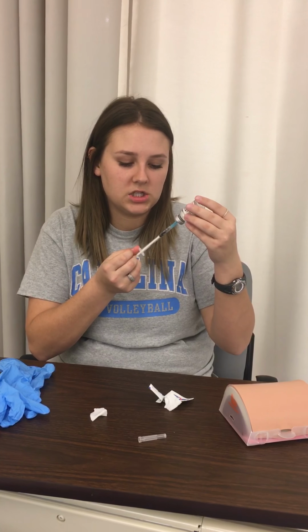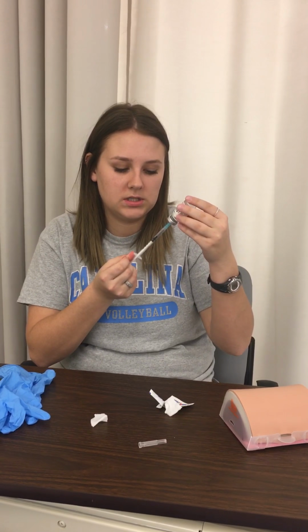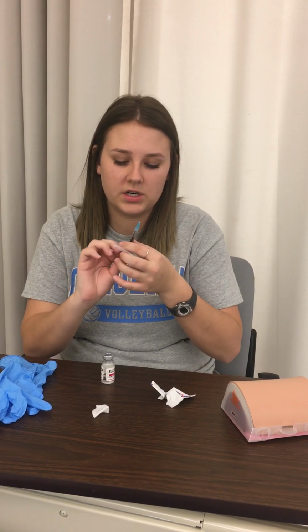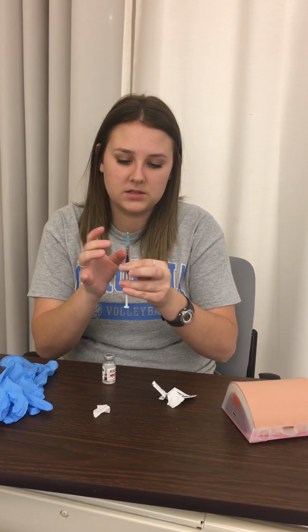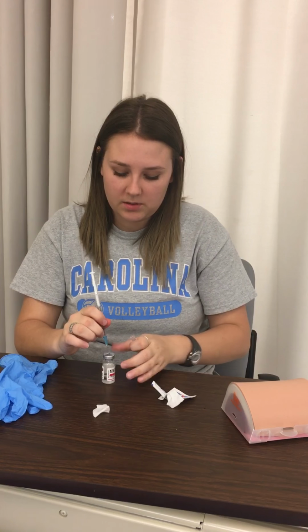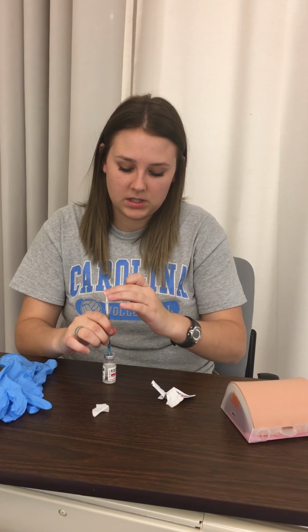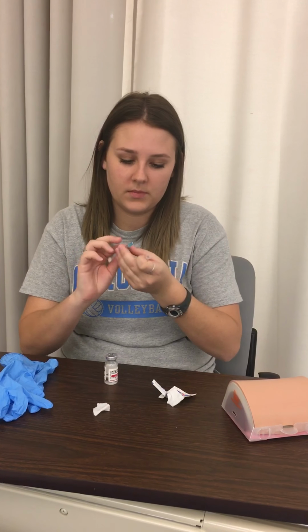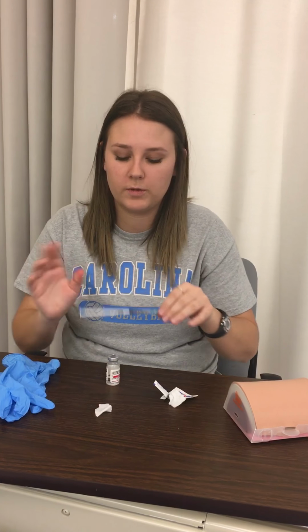And then with certain medications, you're going to want to verify this with another nurse to ensure that you have the correct amount. Okay, so you would recap that. You would change the needle if necessary after expelling any air that's in the syringe. It's just a little bit. Okay, and then I'm going to put the med back in already. Just pretend it's in there. Alrighty, so your medication is prepared. You're going to recap that, so that way you have a safe transfer.